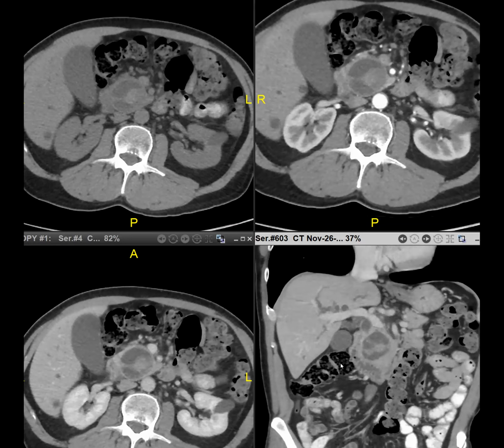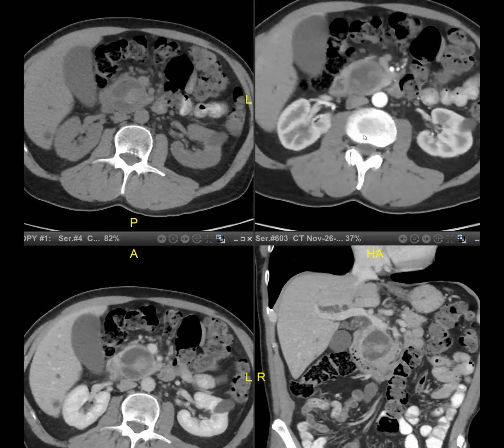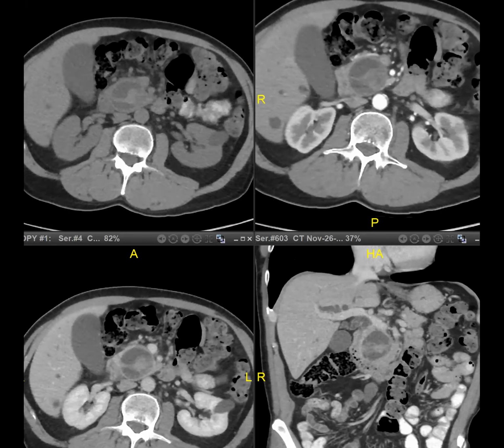Oh my God, isn't that cool? I know, but the thing is, this is the case where you provide a differential diagnosis, and in this case there's no way you can even suggest this as a pre-op diagnosis. By the way, do you have an MR, just out of curiosity? Let's see. I think I don't.